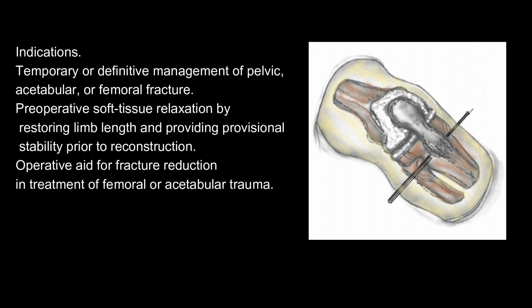Indications: temporary or definitive management of pelvic, acetabulum, or femoral fracture. Preoperative soft tissue relaxation by restoring limb length and providing provisional stability prior to reconstruction. Operative aid for fracture reduction in treatment of femoral or acetabulum trauma.